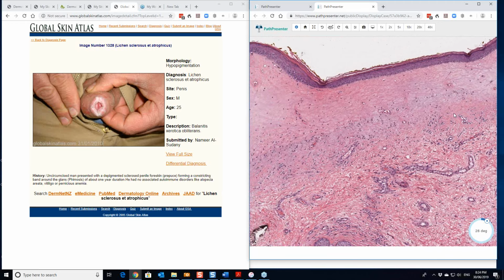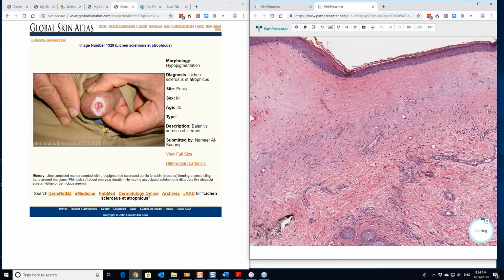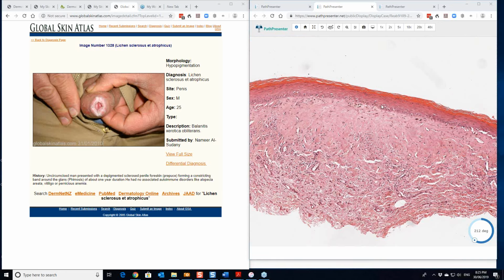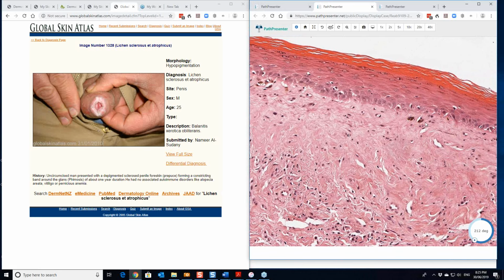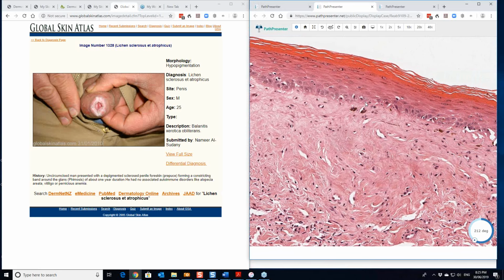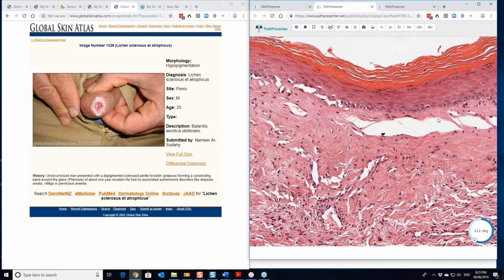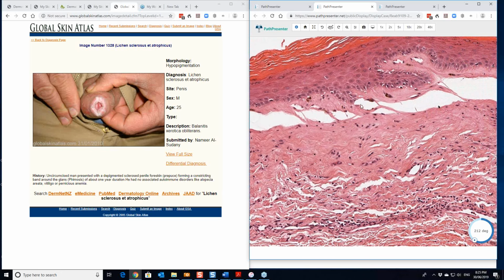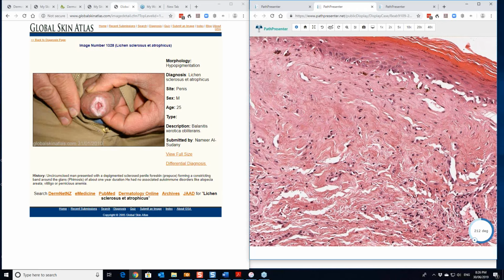Now, I'm sure we've got a couple of other examples of lichen sclerosus. This is what causes that white color that you're seeing. Let me see if I can get some other histopathology for you. This is another one with a relatively mild lymphocytic infiltrate here. Bit of collagen laid down, some damage occurring at the dermo-epidermal junction here. A little bit of pigment there. This keratotic cell. Subtle though. Then you come along here and there's a bit more damage, and this is where separation is occurring. And this would be the imminent blister formation because of lichen sclerosus.